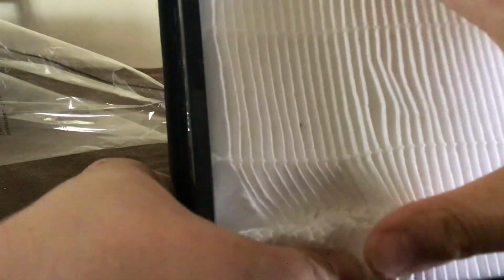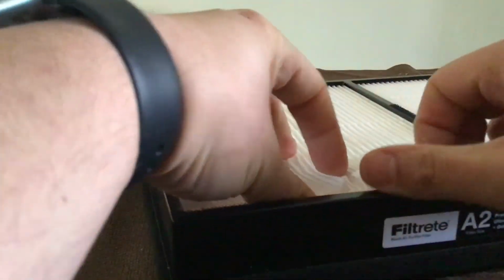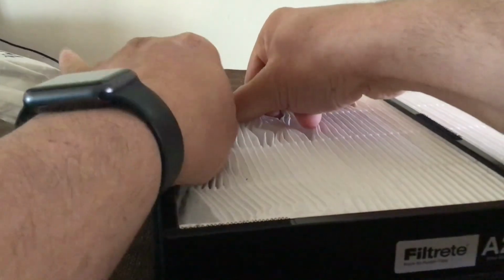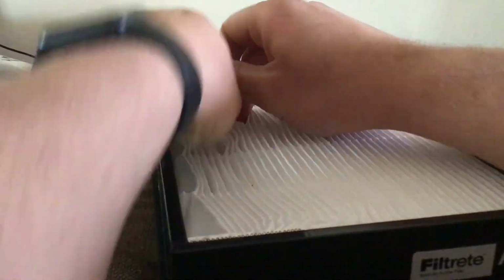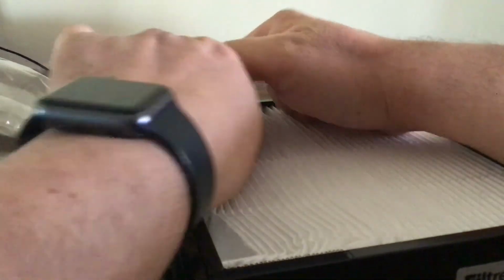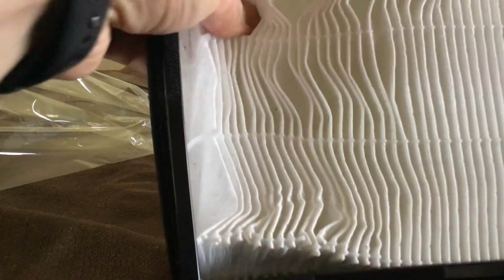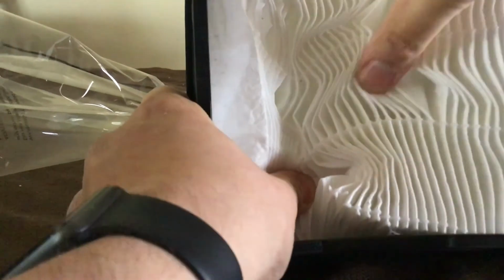Alright, so in that case, what we're going to do is we're going to push this in from the edges, like so, breaking the adhesive seal on the side of the frame here. And then do the same on the opposite side, pulling towards ourselves. Pushing in through the filter itself, like so. This will allow us to pop the filter out of the frame in a moment or so.